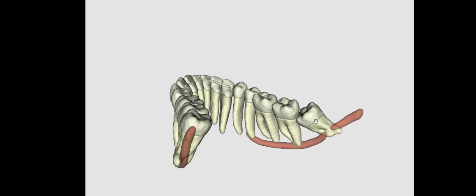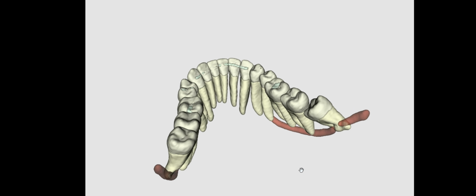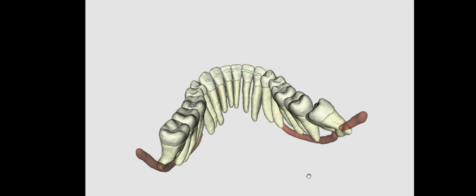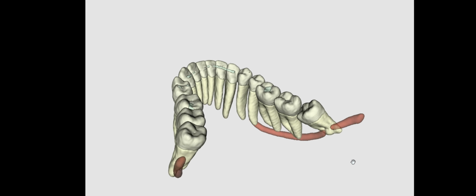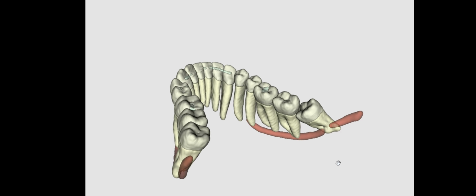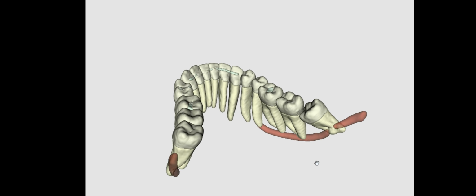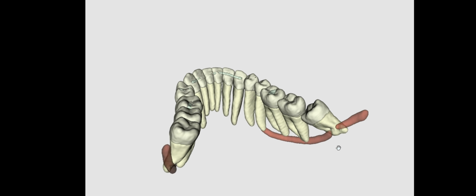On the patient's lower right side, you can see that the nerve tracing disappears in intimate contact with the root there, and that's because it's so intimately involved and compressed against the bone that the AI has trouble recognizing and identifying where it actually traverses. But we get an idea that it does cross across there where that notch in the root occurs.